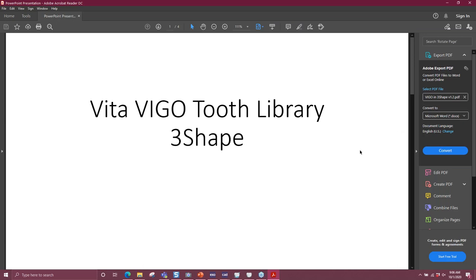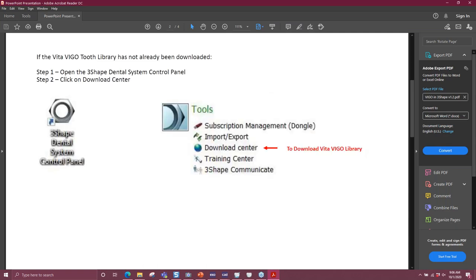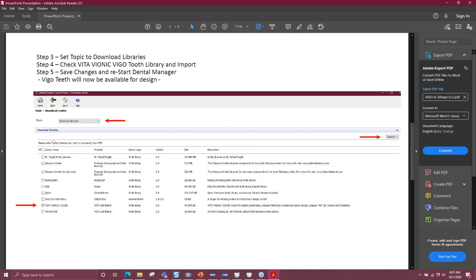So here is how you're going to get it in 3Shape. 3Shape should be very easy because you don't have to request anything from anyone — you can do it directly from your software as it is. You're going to look for the Dental System Control Panel, go to the Download Center, and import the Vita Vionic.